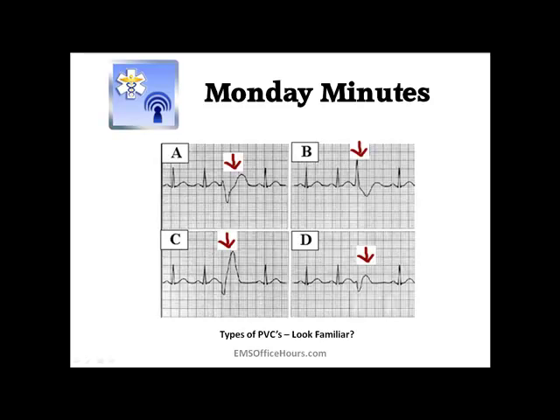Let's take a quick look at some of the types of PVCs you might see in the field. C looks like a pretty common type of PVC you might see, but B — you might not necessarily catch that as being a PVC. You might say, oh, that's just sort of an inverted T wave or something. You might not really catch that if there's only one or two on a strip. And look at D — even that's not too crazy. It's not really wide like A or C, and you might not recognize that as being a PVC.